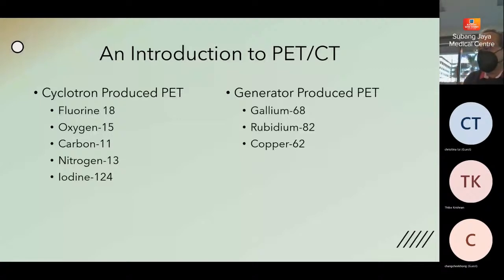So another thing that PET scan does is that it's actually a scan that has some semi-quantitative properties, and I'm sure that we see it in the PET scan reports. We look at SUV. It measures the amount of activity in a given tumor, and basically the formula for SUV is the tissue tracer concentration divided by the injected dose divided by body weight. So the SUV is dependent on the patient size.